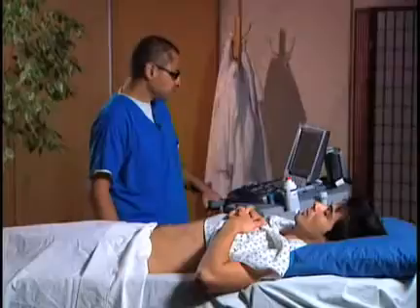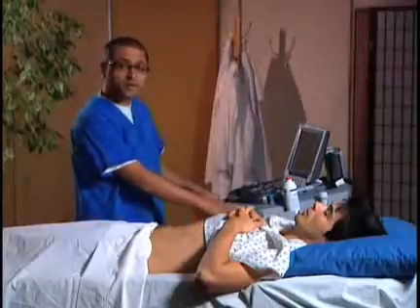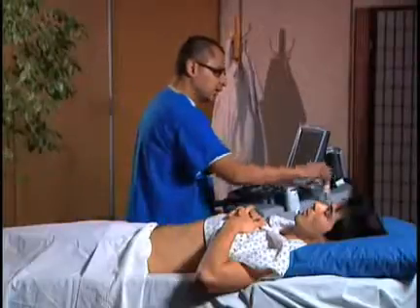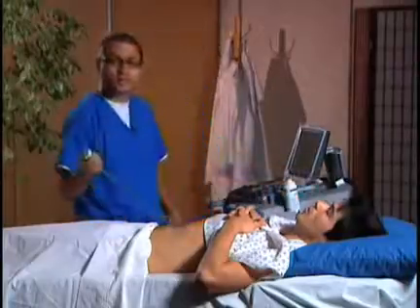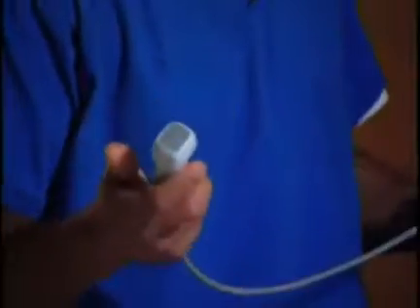Let me take you through it. We have our M-Turbo system here. It's already powered up and on. We have a selection of 2 different transducers. Most of you may already have this transducer. This is a phased array transducer. This is the same transducer you're going to use for the FAST exam and for echocardiography.